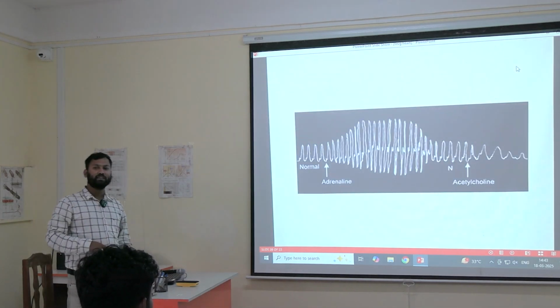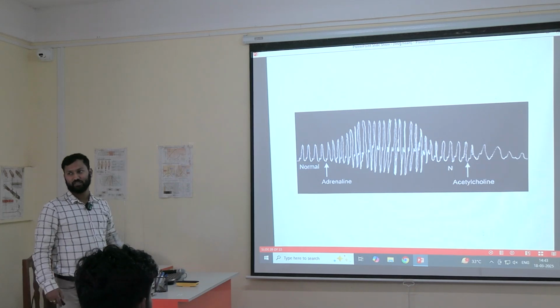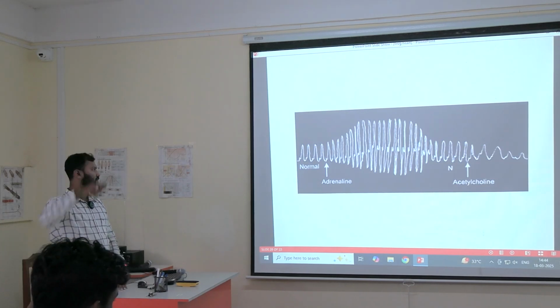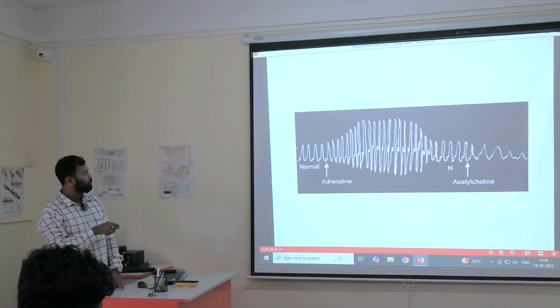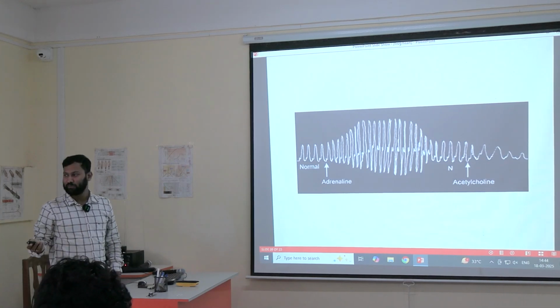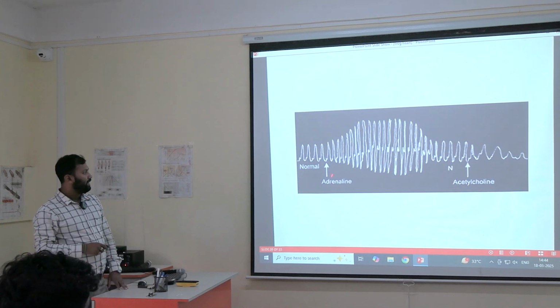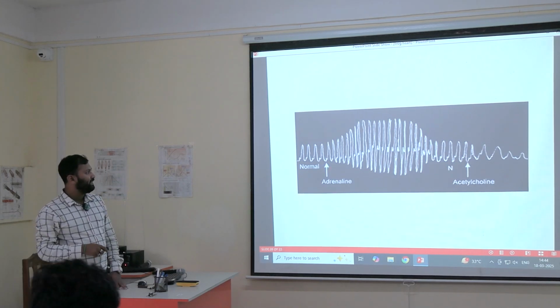So now we will be seeing the effect of some drugs on the heart rate. So first one is the normal heart rate at normal room temperature, in normal Ringer's solution. Now what we are doing, we are adding adrenaline.